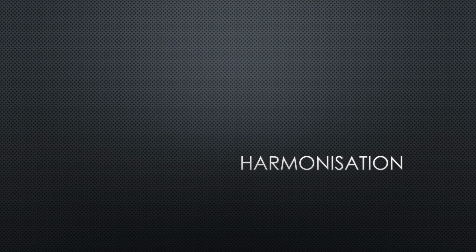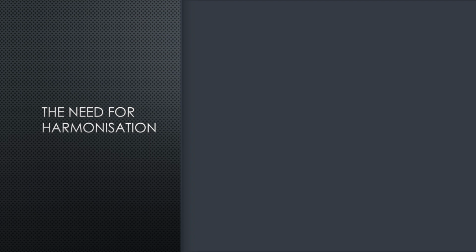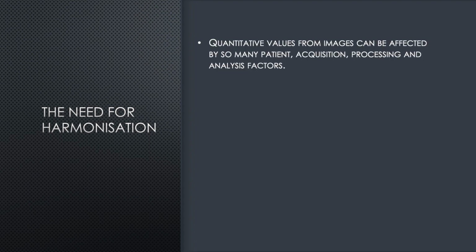So there are a number of challenges, and I just want to put an advert out for harmonization, because if we harmonize what we do across sites, across centers, we can help at least get consistency in the quantification across our sites. So why do we need this harmonization? Well, we've just seen that quantitative values that we get from images can be affected by so many factors, be them patient, acquisition, processing, and analysis factors.